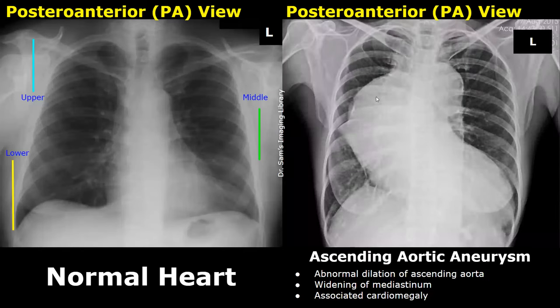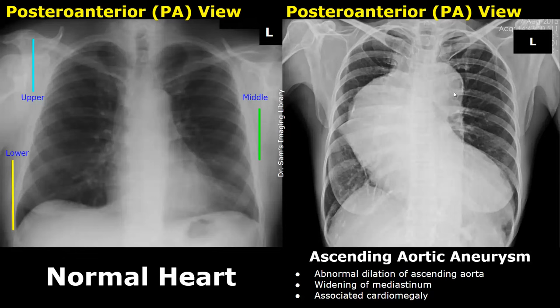Here is another image of aortic aneurysm — this is ascending aortic aneurysm. The left ventricle of the heart appears enlarged along with abnormal dilatation of the aorta. X-ray is not very good at determining the extent of the aortic aneurysm; further examination is required such as CT angiography.